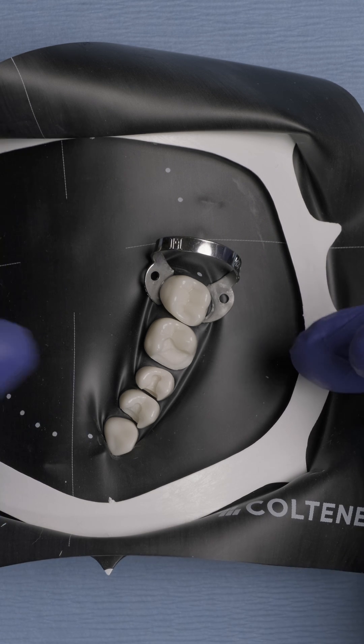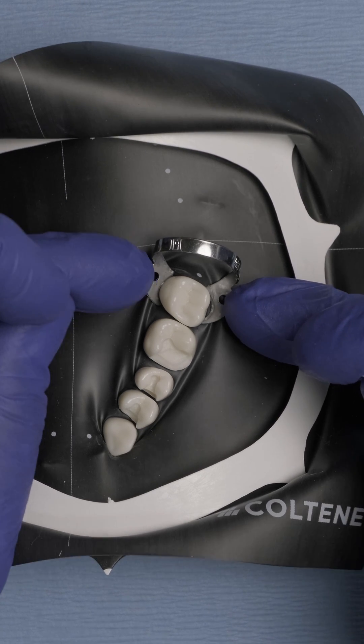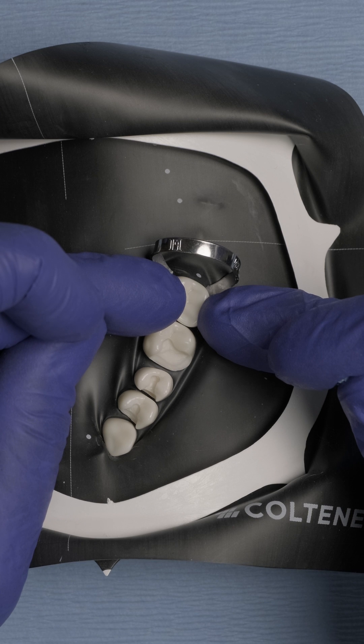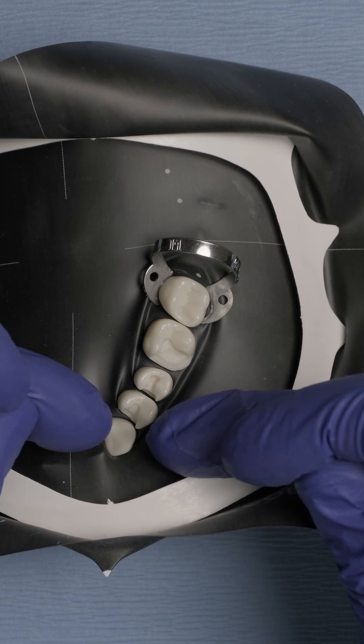As you can see, we have now isolated the area. We have our W3 clamp as a retentive clamp on the second molar. We have isolated the first molar, the second premolar, the first premolar, and the canine.